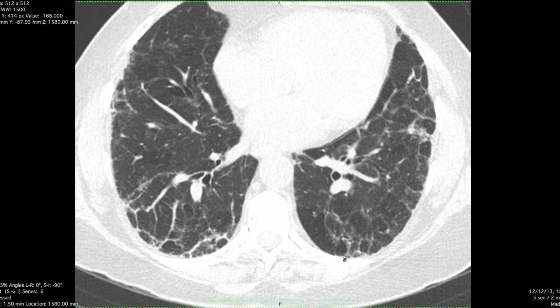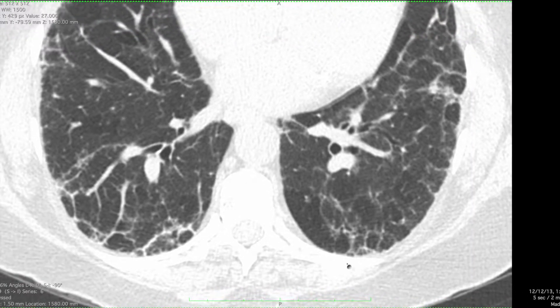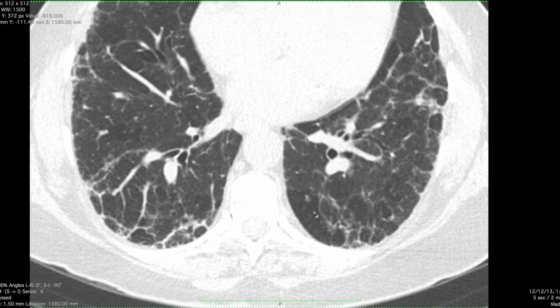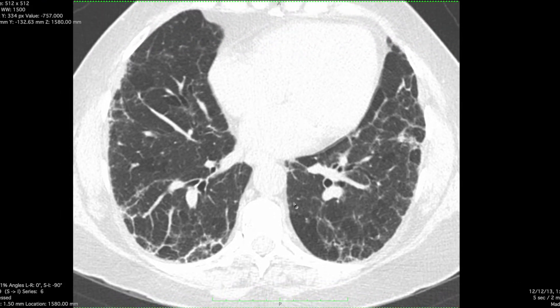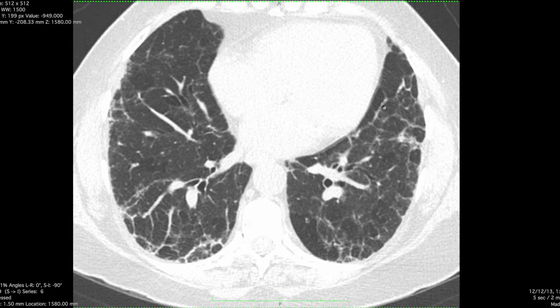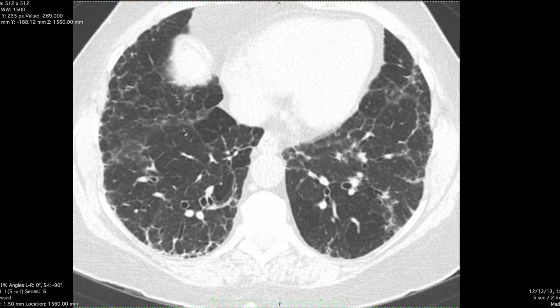Someone might even quibble if maybe there's early subpleural honeycombing. If you look carefully at the CT pattern, you'll also notice that there are some secondary pulmonary lobules which look lower density than adjacent normal lung. So that's consistent with mosaic attenuation.